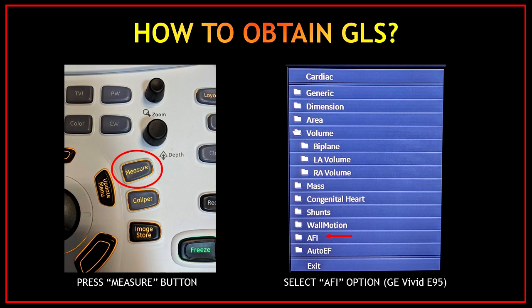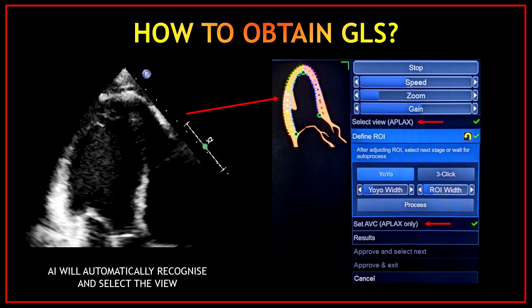Once you have your images, press the measure button and select the AFI option from the measurement package. Once you click the AFI button, the artificial intelligence from the software will automatically recognize and select the view. Following the red arrow, we can see that the machine is recognizing this as the apical three-chamber view.